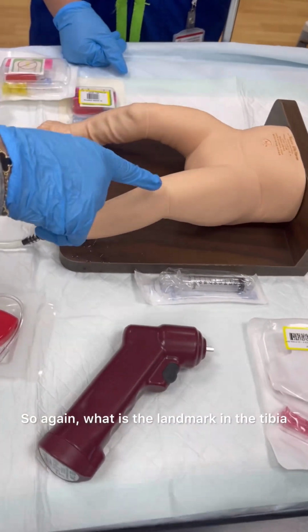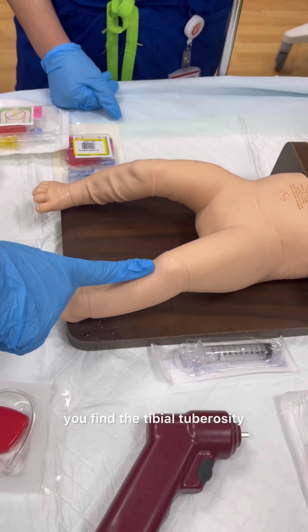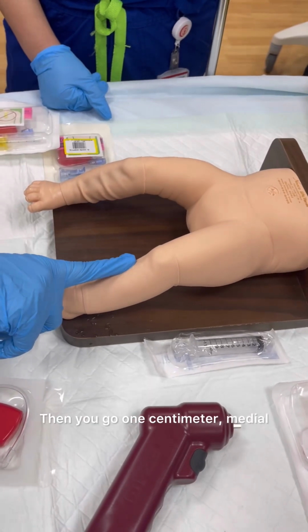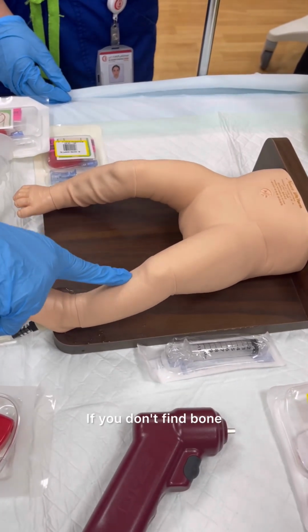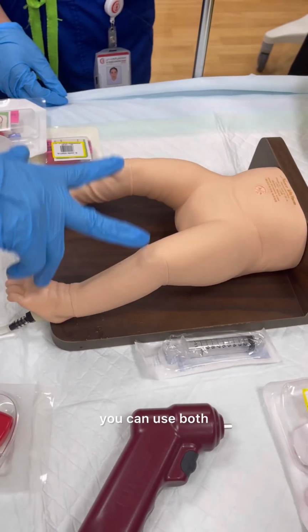So again, what is the landmark in the tibia? The tibial tuberosity. You find the knee, you go down, you find the tibial tuberosity, which is the first ridge. Then you go 1 centimeter medial, and this is where your needle should go. It has to go into a bone. If you don't find bone, then you have a problem. So this is one way. You've got two tibias, you can use both.